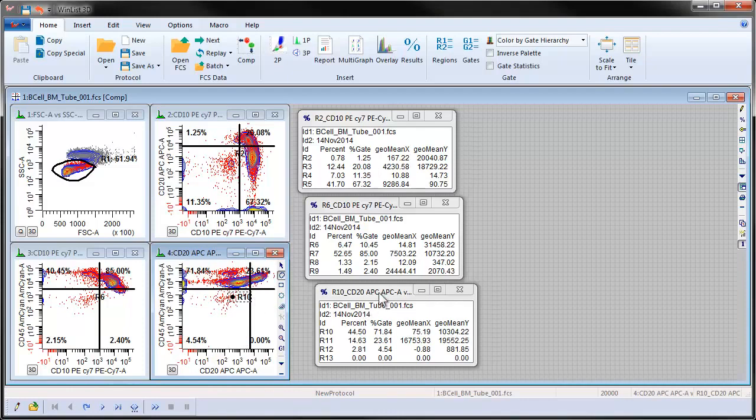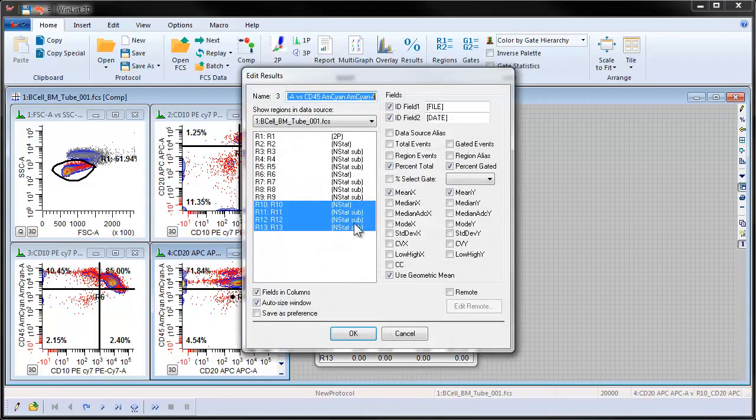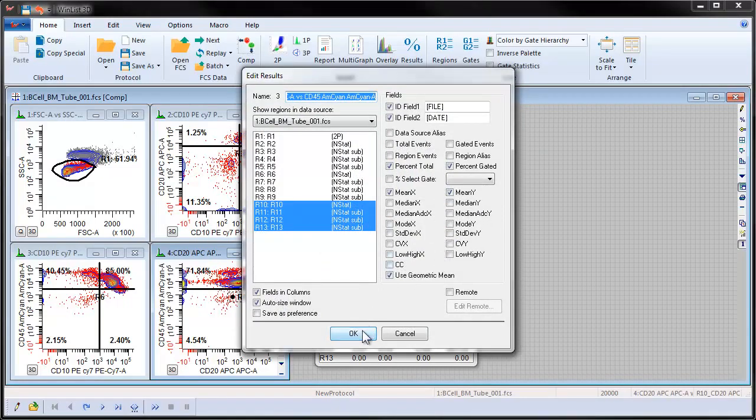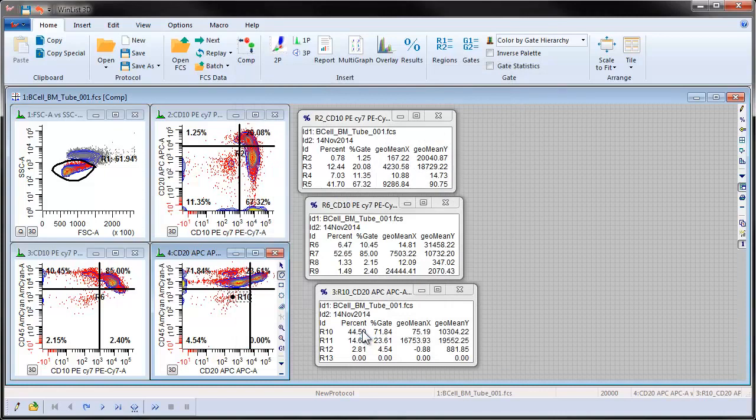You can double-click the title bar of a results window to select the regions of interest and the various statistics you may need. When ready, click OK to close the dialog.